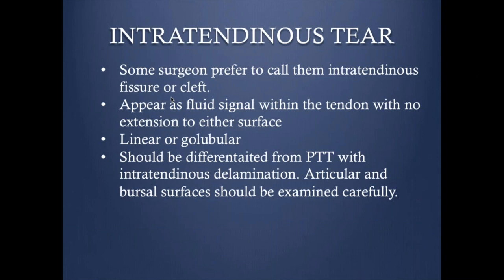Let's start with the spectrum: the intratendinous tear. Some surgeons don't like to call it a tear because that confuses the patient into thinking they need surgery. Actually, these are usually managed conservatively. So some people call them intrasubstance cleft or fissuring. How do we differentiate this from tendinopathy? It is when we see a fluid signal within the tendon with no extension to either surface. It could be linear or globular in appearance.